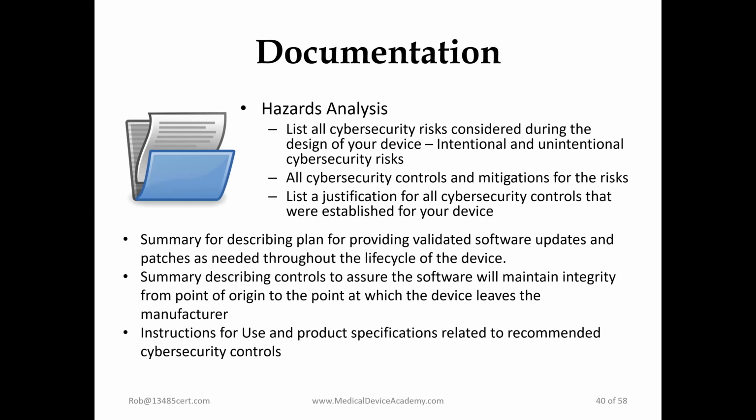So as far as the documentation required relating to cybersecurity in your 510K submission, these are the specific elements that they require, and then there's more on the next slide. But to start, they want to see cybersecurity risks identified in the hazard analysis. They want to make sure that there are controls and mitigations for the risks, and that there's a justification for those controls.